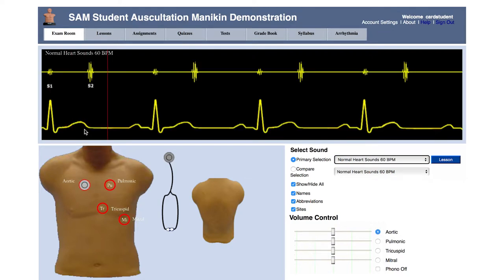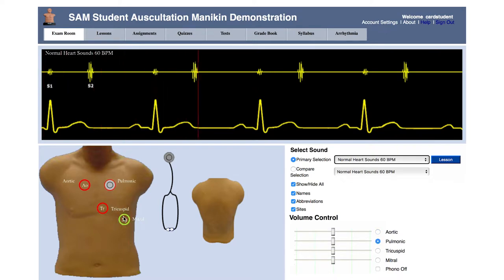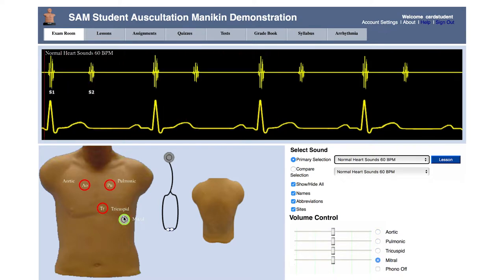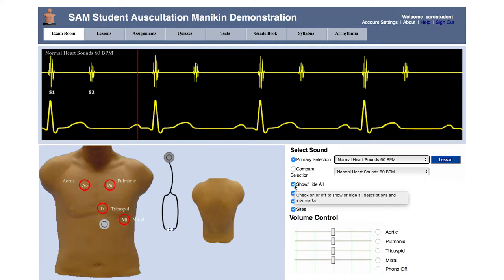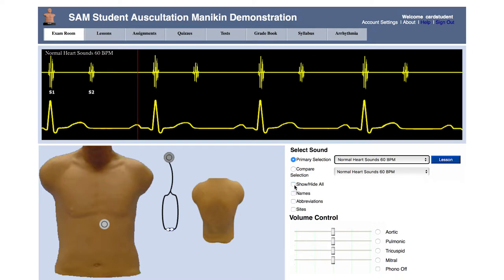Simply click on the desired auscultation site, and the sound will automatically begin playing. To stop playing a sound, drag the stethoscope icon outside one of the auscultation sites. If you'd like to practice placement without the names and diagrams in the way, click hide all.